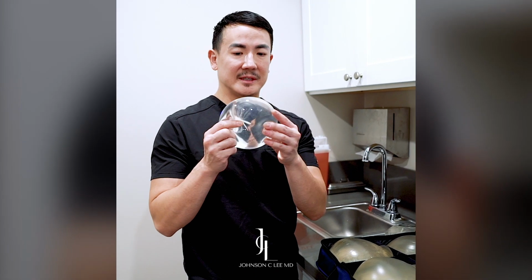So the implants actually look like this. This is a 550cc implant, but if I were to put this under your shirt or in a bra, it's going to look very awkward, very lumpy. That's not how they look when they're under your breast. So that's where these sizing molds come in.